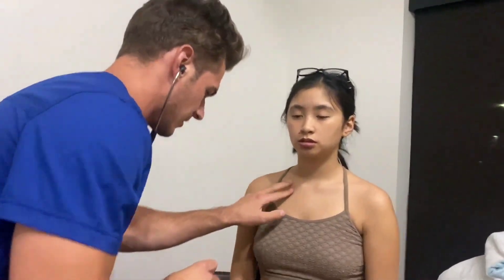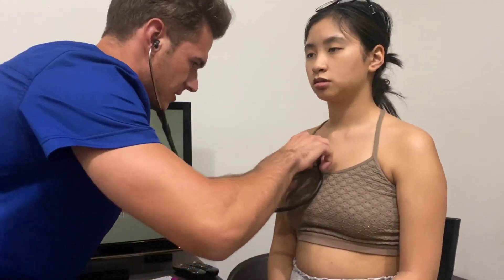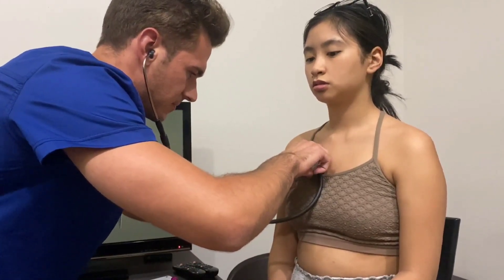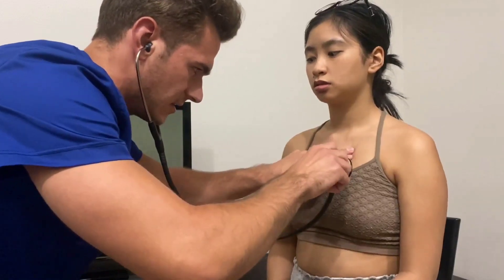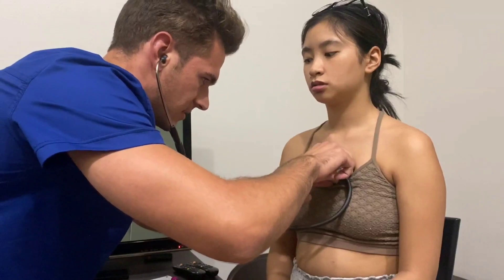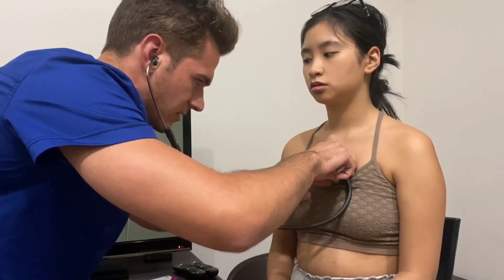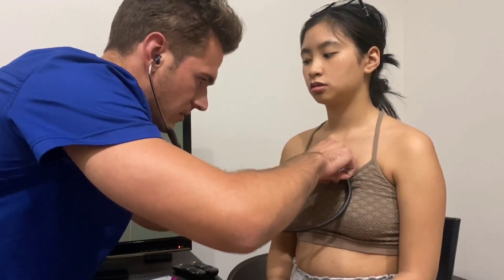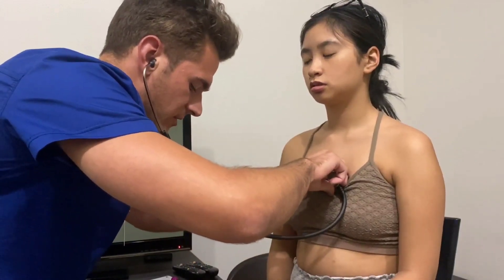Let's check different regions of the heart. Going to the second intercostal space on the right — this is the aortic region, right of the sternal border. Same on this side: second intercostal space left of the sternal border is the pulmonic region. Then third intercostal down is Erb's point, where you can hear murmurs.